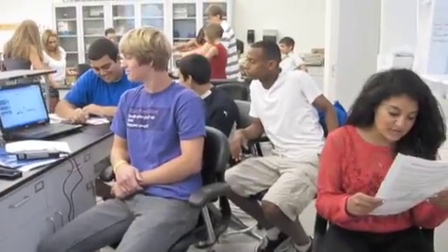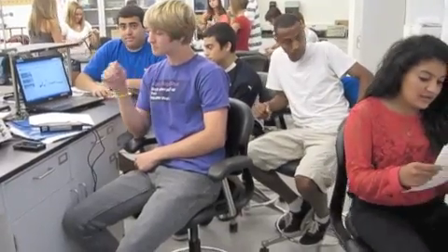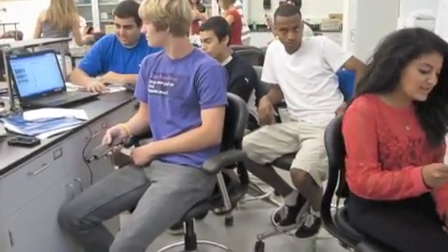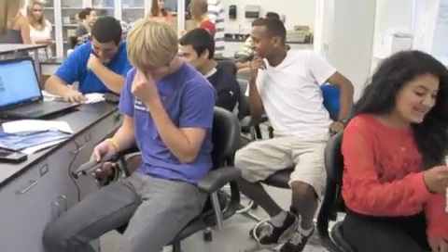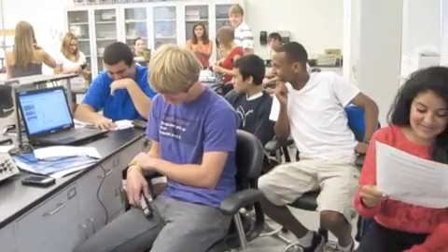What we are going to do is measure how much strength a person has in their grip. Along with this, we will measure the person pinching too. When we measure the pinching, the person will pinch with their thumb and test out all their other fingers. For the hand grip, we will test the dominant and non-dominant hand, and for the pinching, we will only do dominant. Our subject today is Bruce. Bruce is our subject because he is strong and works out, and pretty much lives in the gym. Out of our whole class, he has gotten the highest, which will be shown when we demonstrate our lab.